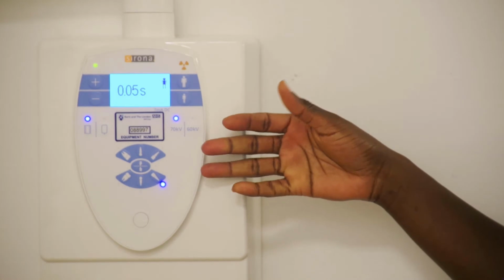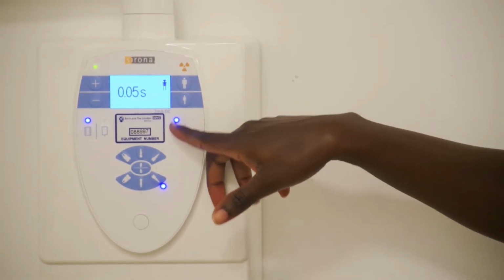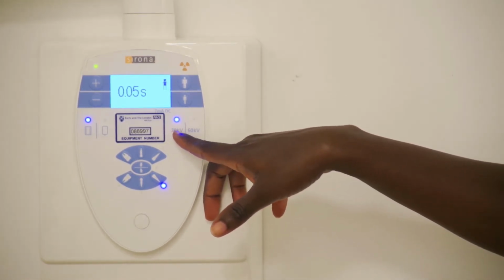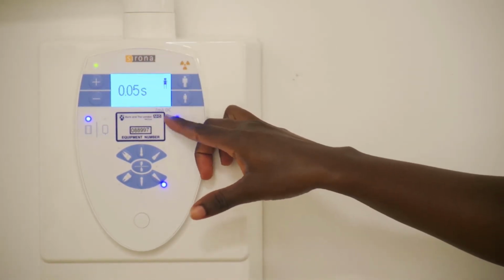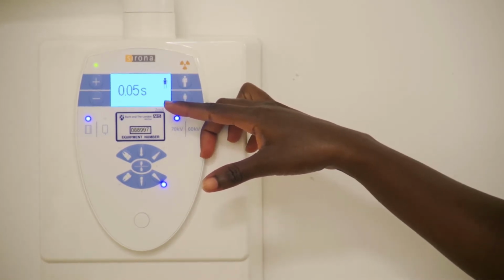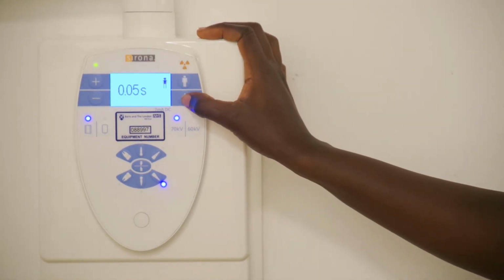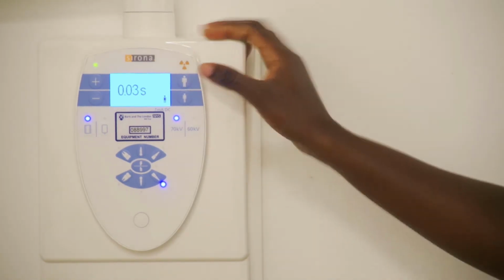Okay, so this is the control panel. Like I mentioned, you've got your kV 60, 70, but you'd want to keep it on 70 because that's the optimum you need to get a good image. The mA is set at 7. You've also got different patient sizes. If you've got an adult and a child, you will not be using the same exposure. If it's an adult, you click on adult. If it's a child, you click on child, and if you can see here, the exposure time decreases.